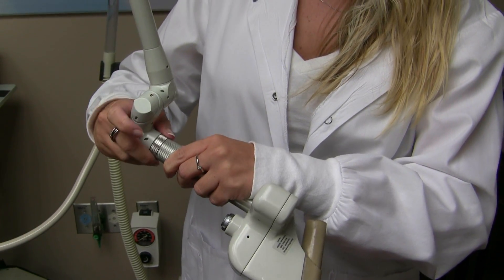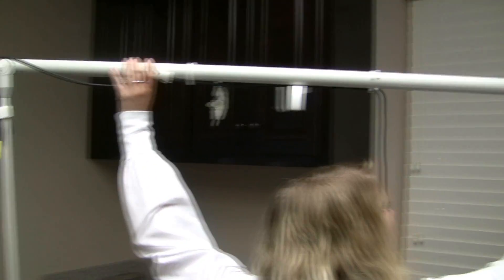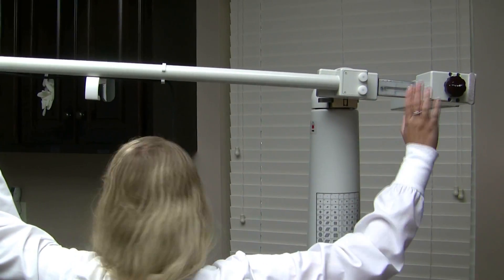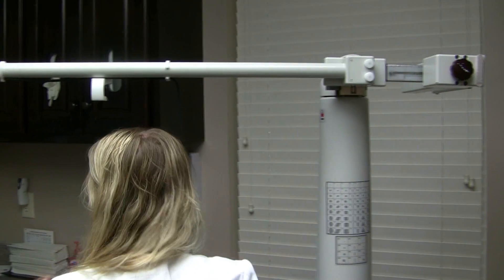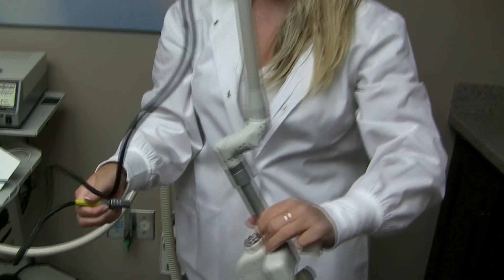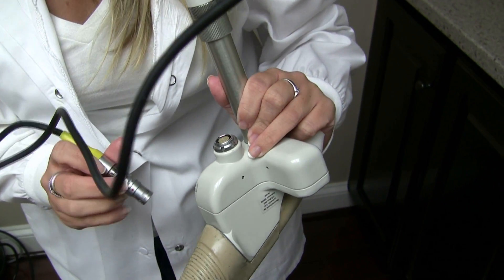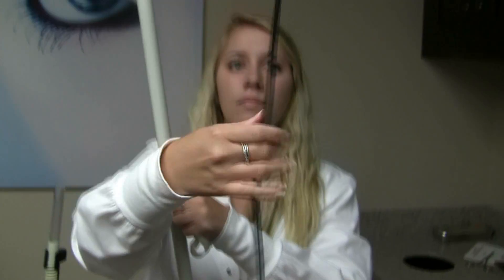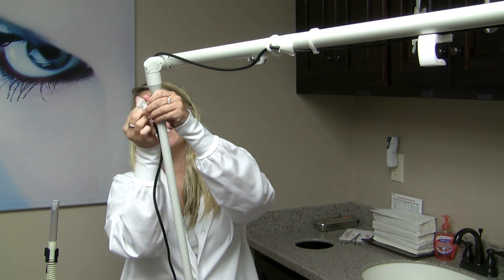Once the CPG handpiece is on and level, Alyssa comes back over and attaches it to the arm — hold the silver on the arm and screw it in. She levels it out. Up top, we have the cord taped by Velcro that connects to the CPG handpiece and to the Deep FX. She shows where the red dot is — there is a notch it matches up to — and it just clicks right in. Then she re-Velcros the black cord to the laser arm so it does not get in the doctor's way.